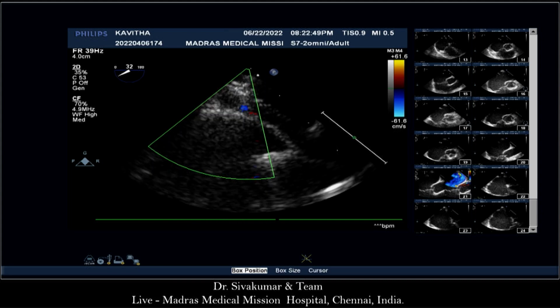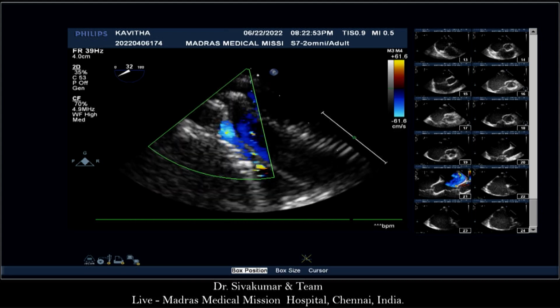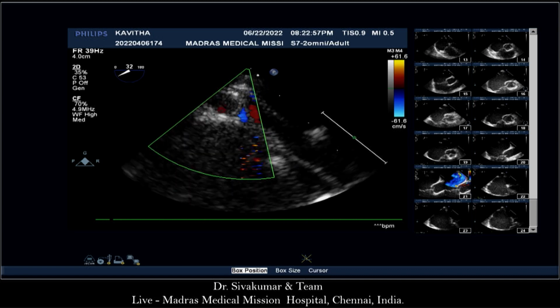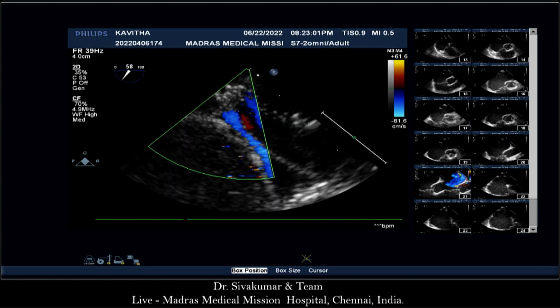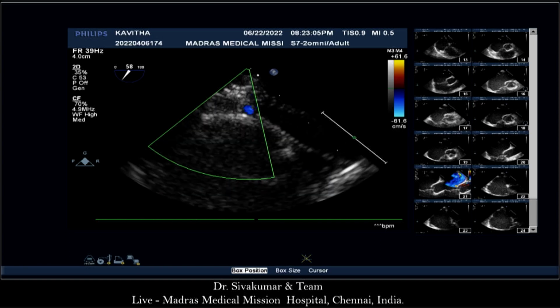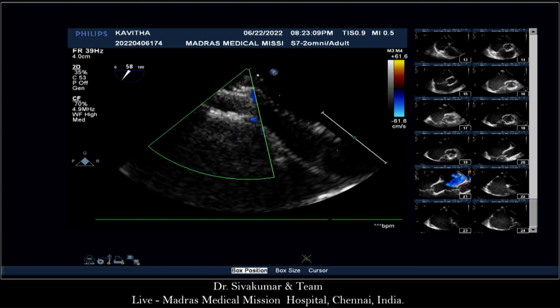Shiva, what we need to see here is a mitral valve. Yeah, we'll show every margin. Now I'm concentrating on the postero-inferior. Now keep going down, 50, 60. Yeah, I'm going down. Perfect. Okay, now push it inside a little bit. Slightly retroflex. I'm able to see the inferior margin. That's fine. Okay, now come to 90 degree.